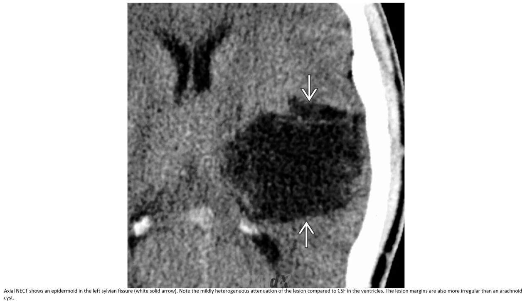Axial non-contrast CT showing an epidermoid in the left sylvian fissure. Note the mildly heterogeneous attenuation of the lesion compared to CSF in the ventricle. The lesion margins are also more irregular than an arachnoid cyst.